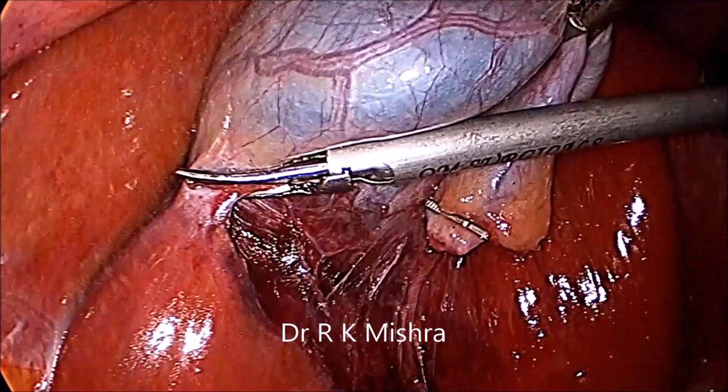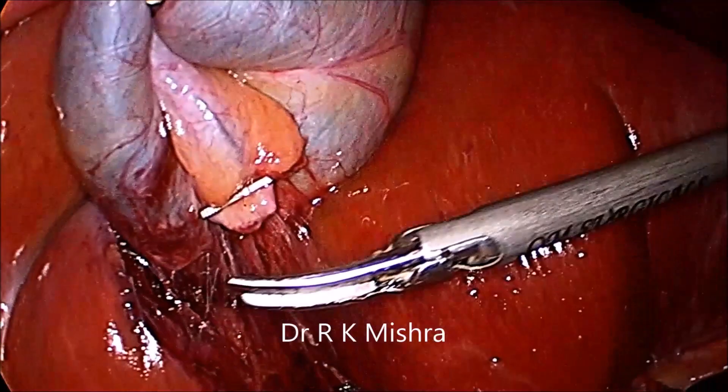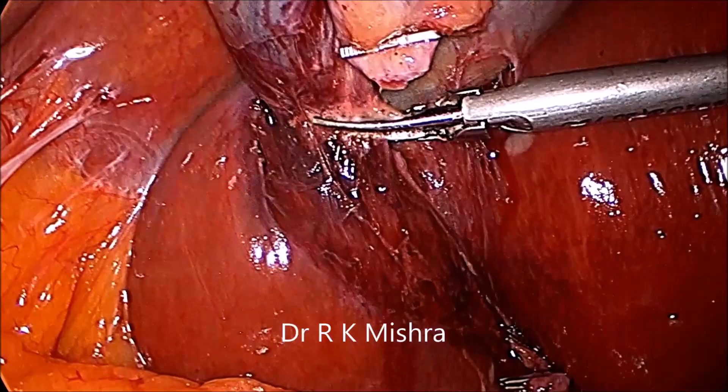Anteromedial and anterolateral traction has to be given, and slowly you can separate it. First the peritoneum of the gallbladder should be separated, so that it will achieve a good avascular plane.